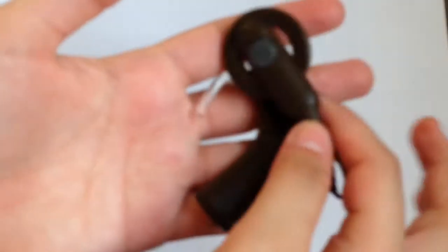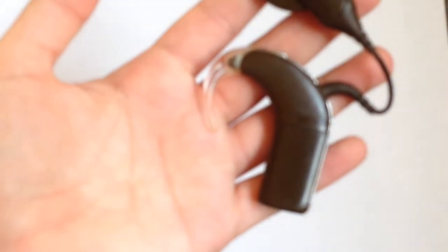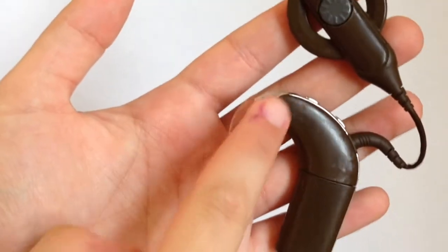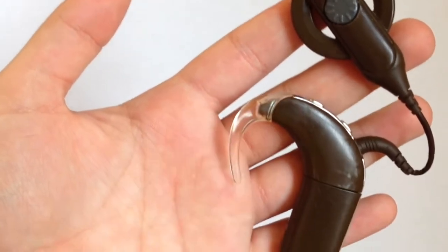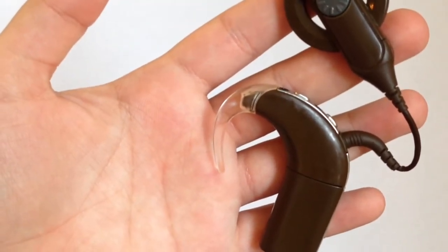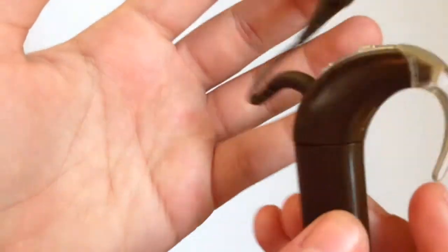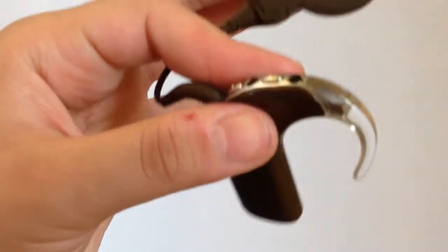Okay, so as you guys can see, this is the Nucleus 5 Cochlear Implant that I have with me right now. And this over here, this plastic thing, that's called the hook, and that is what helps keep the cochlear implant on your ear or on whoever is wearing it. So, it's on really, really tightly.